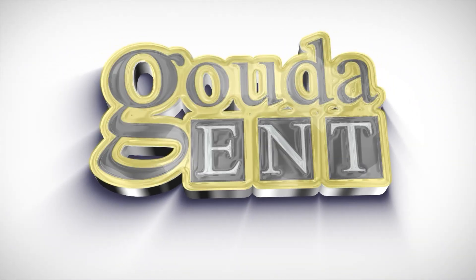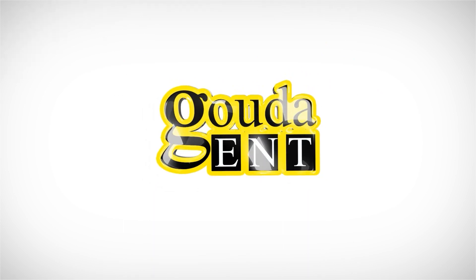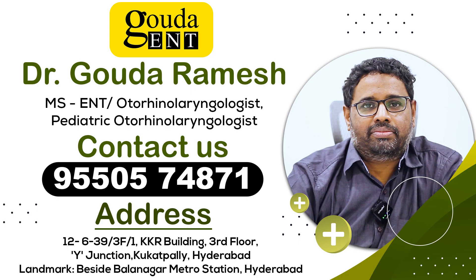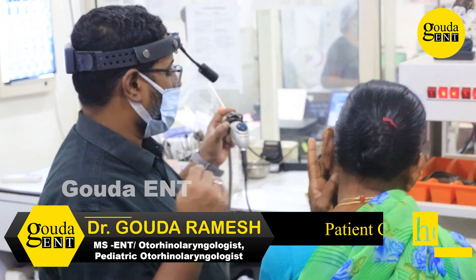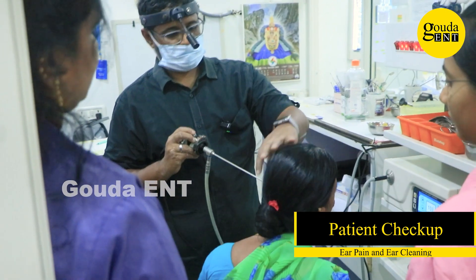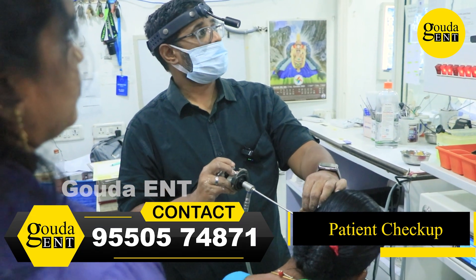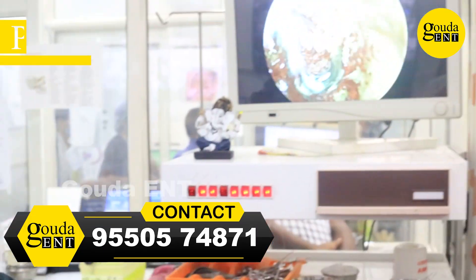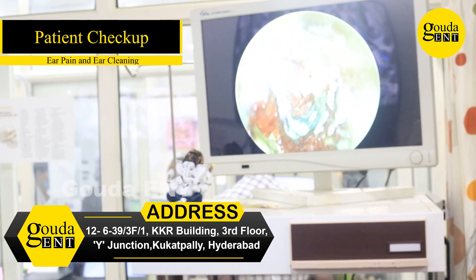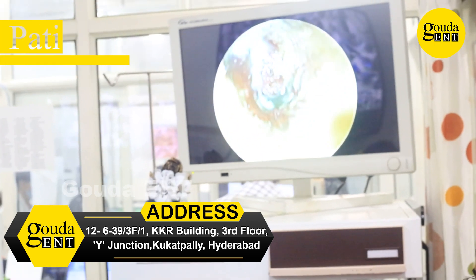Hello. I am going to take a look at the syringing procedure. This is at the next level.